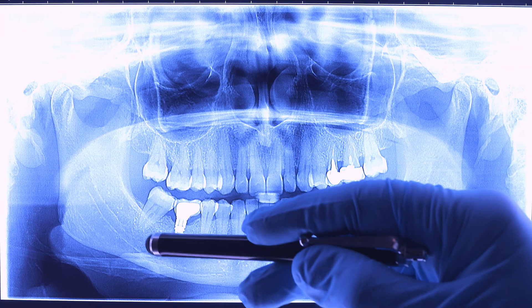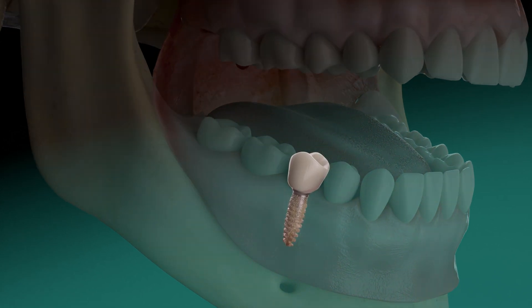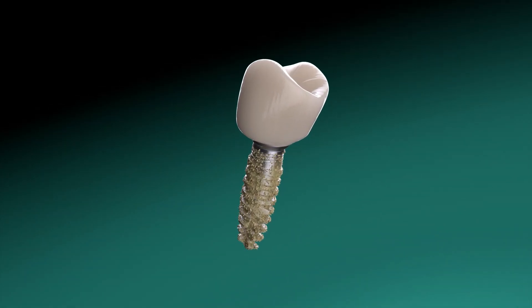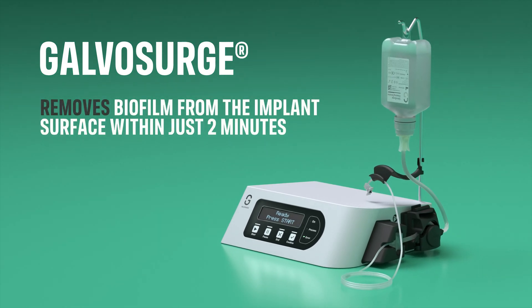Dental implants have evolved into a highly effective solution for replacing missing teeth. However, accumulation of biofilm around implants may lead to peri-implantitis. Revolutionize biofilm removal in peri-implantitis treatment with Galvosurge.